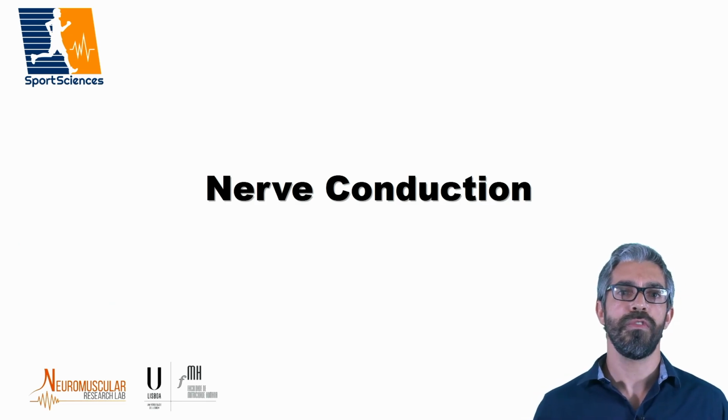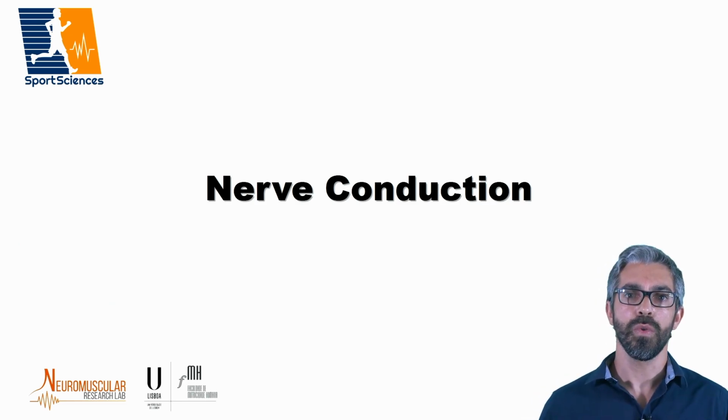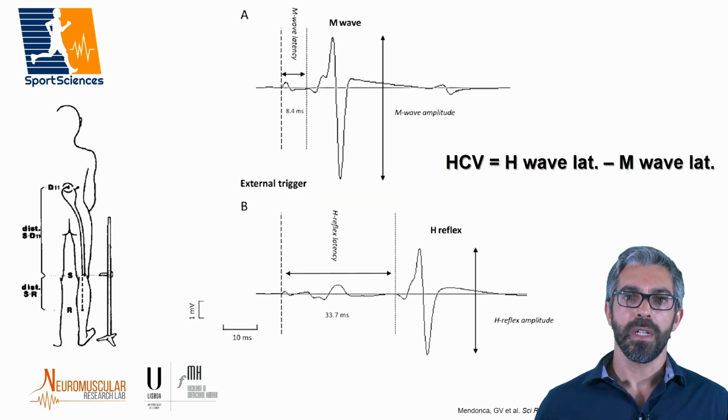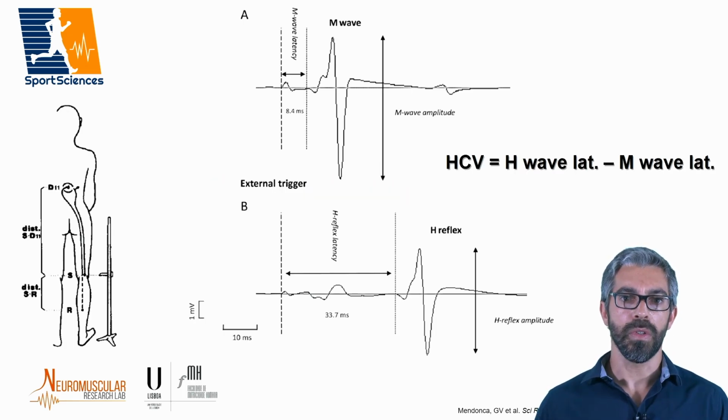Stimulation also provides a valuable insight into the integrity of nerve conduction. Besides enabling the quantification of conduction amplitude, as expressed by the amplitude of the evoked potentials, it also translates the velocity of the impulse traveled between the stimulation point and the muscle.